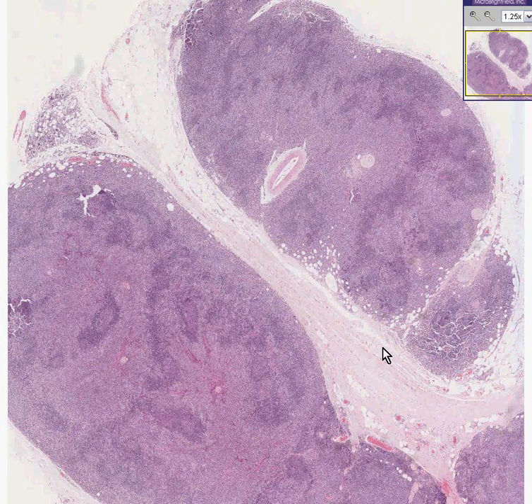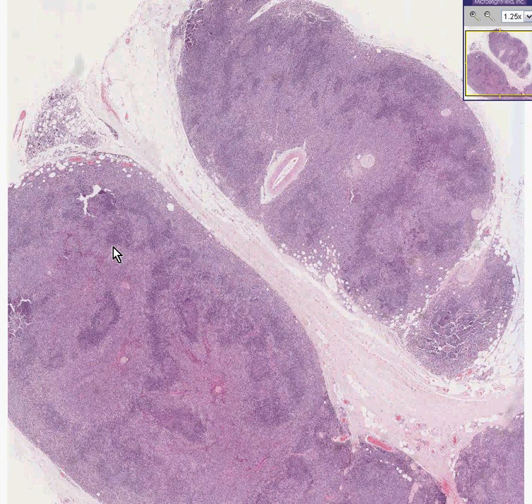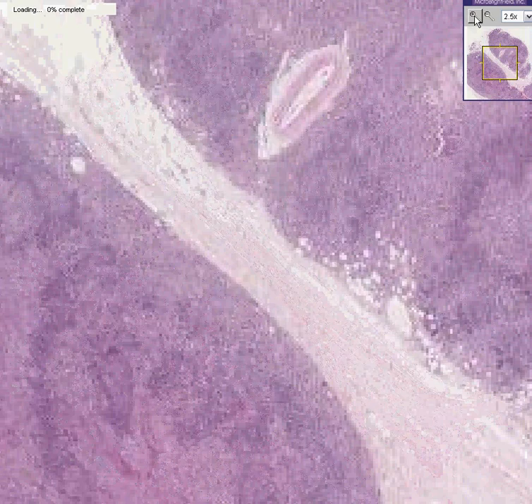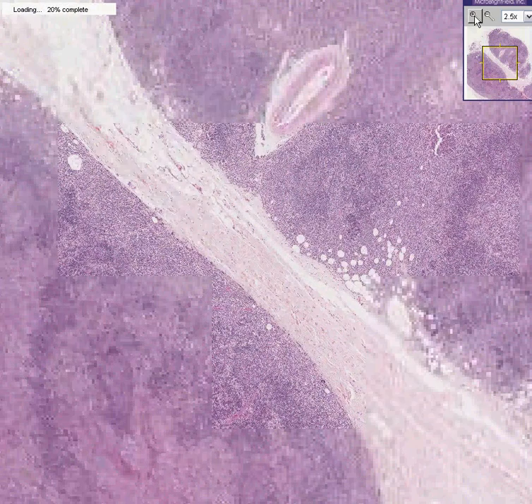Here is another lymph node. You could see the architecture is lost and replaced by collections and arrays of lymphoid cells which show no semblance or resemblance to a normal architecture of a lymph node. So by definition, that is a malignant lymphoma.